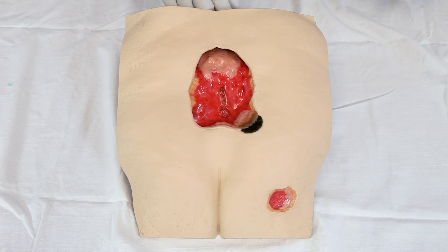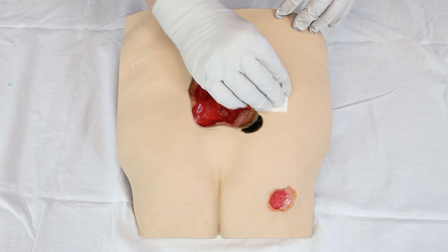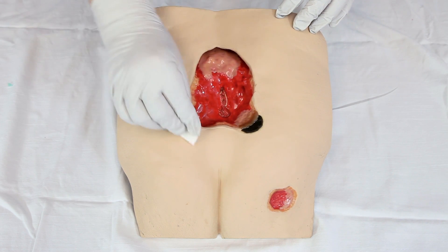If available, the best technique to prepare the area for better adherence is to apply a skin barrier surrounding the peri-wound area.